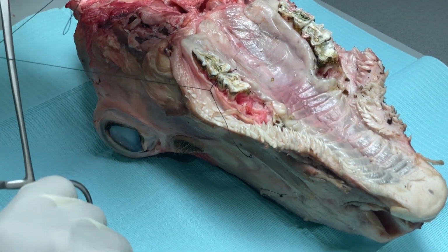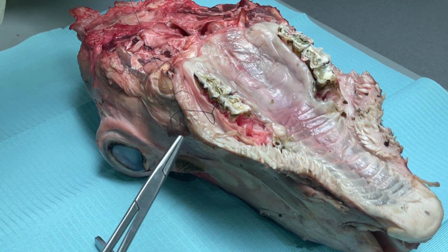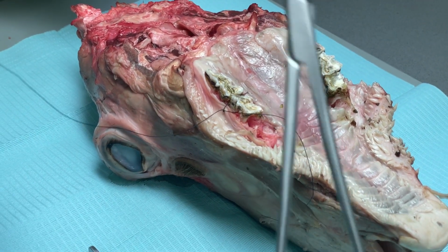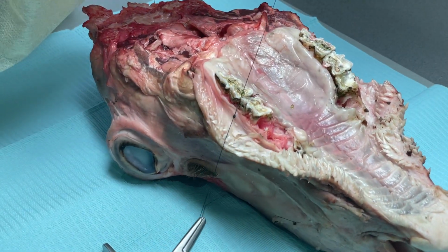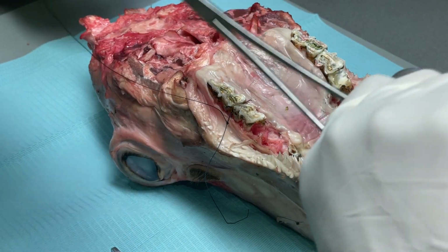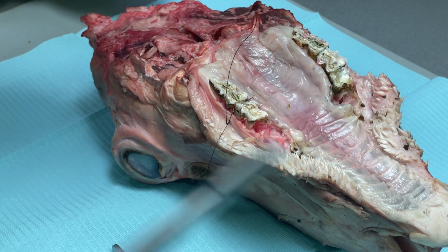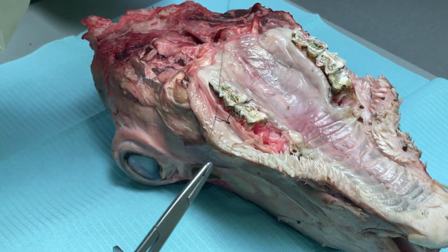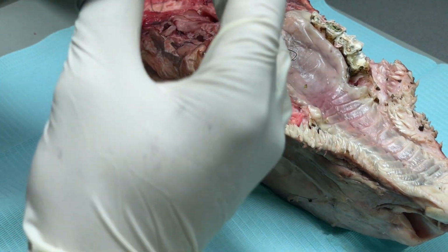Now one anti-clockwise. Hold it, in the opposite direction like this. One more clockwise. Hold it, opposite direction. Just with a clockwise, one, two. Hold, lock. The other way, anti-clockwise, you come from the left. Anti-clockwise, one, like this. Again one more clockwise, and clear?